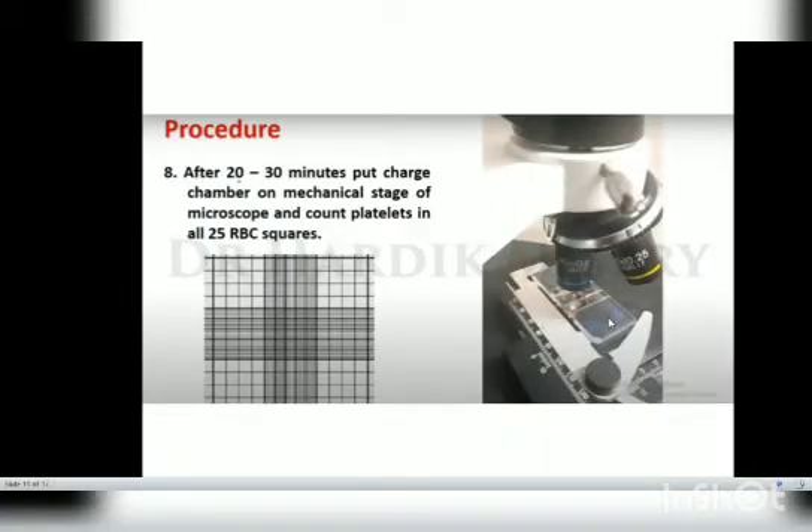After 20 to 30 minutes, remove the chamber, wipe off the moisture using a tissue paper, and identify the improved Neubauer counting chamber. Then observe under the microscope. Place the charged chamber on the mechanical stage of the microscope and count the platelets in only 25 RBC squares.